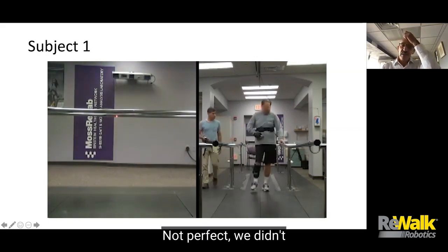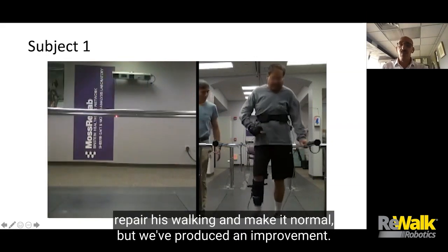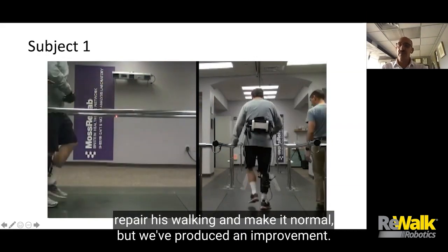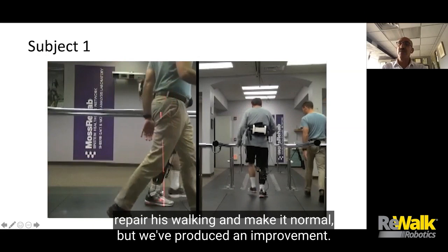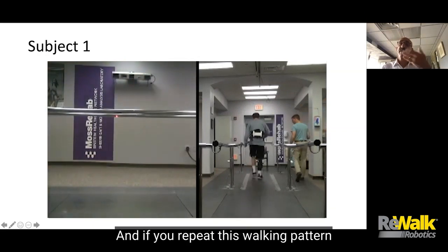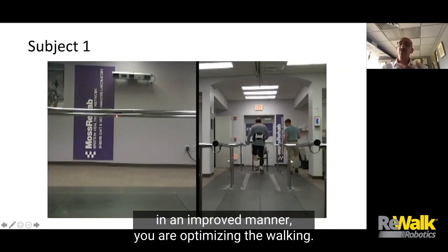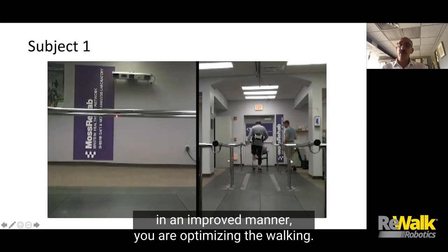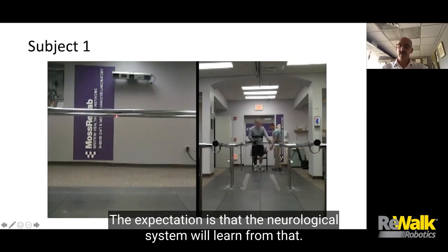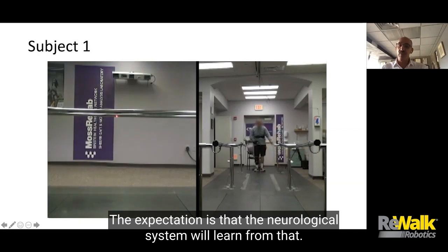Not perfect. We didn't repair his walking and make it normal, but we've produced an improvement. And if you repeat this walking pattern in an improved manner, you're optimizing the walking. The expectation is that the neurological system will learn from that.